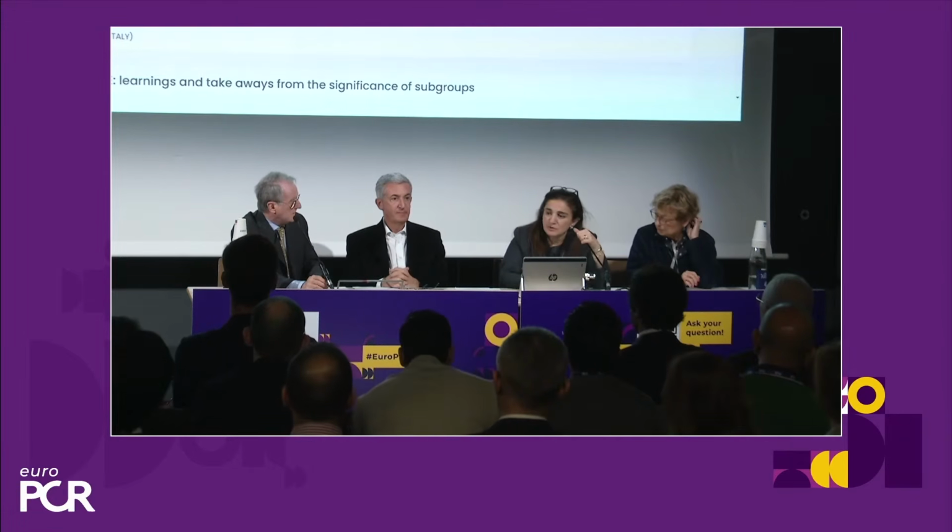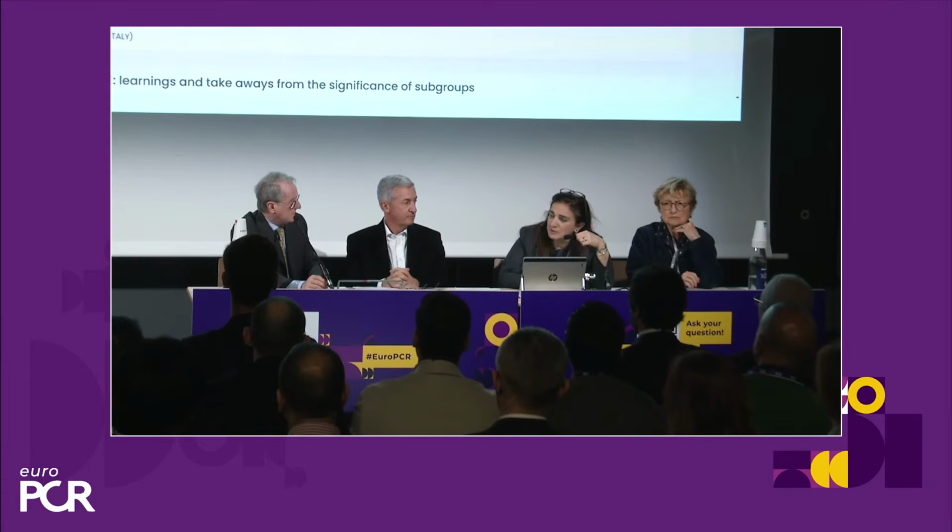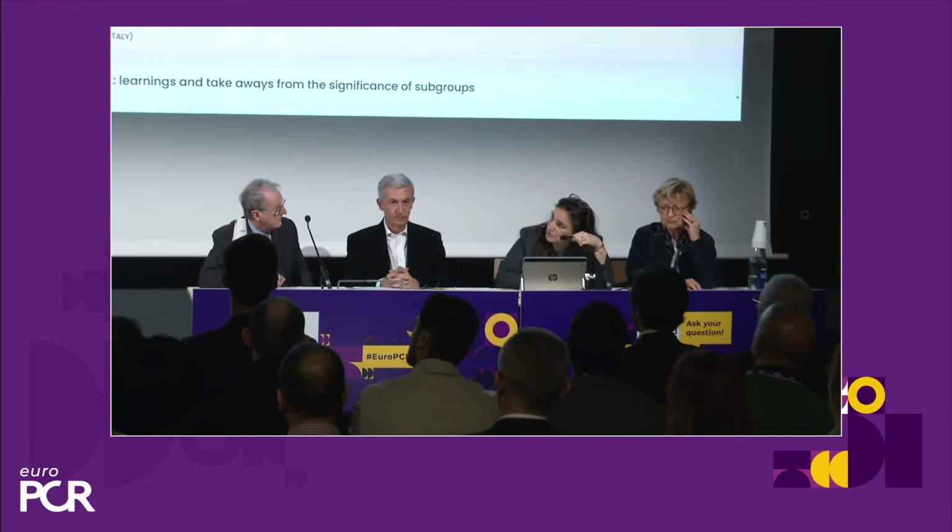Short question. What you showed us was the downstream effect. What's going on in the vessel wall when you are blowing up the balloon, and what's happening to some of the crystalline that is staying there? Is there also inflammation in the vessel wall? There is some inflammation. There's some fibrin formation, but there's not a lot of inflammation.